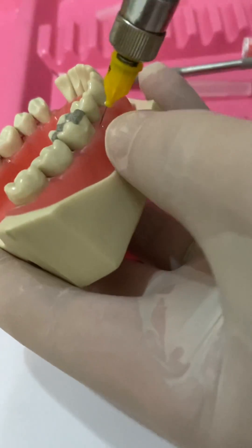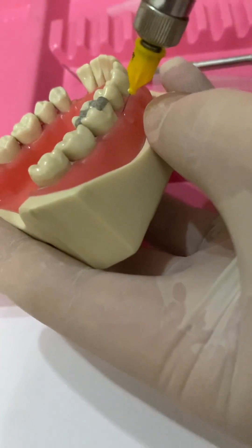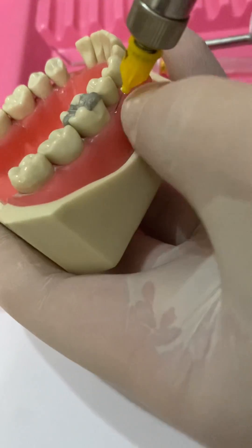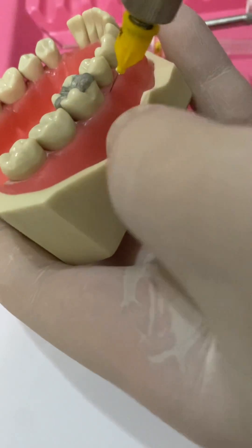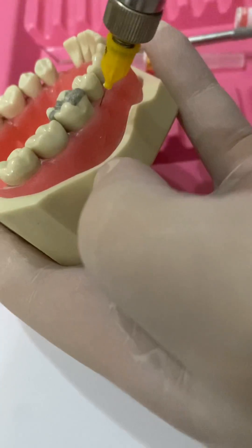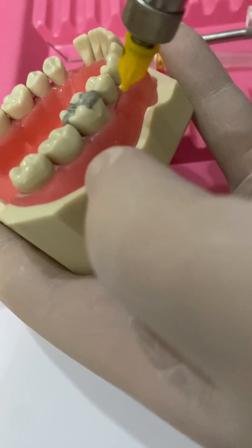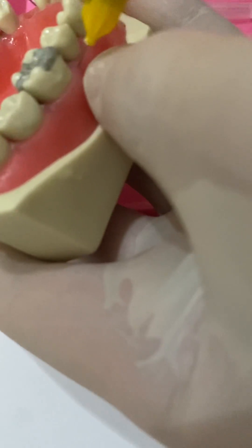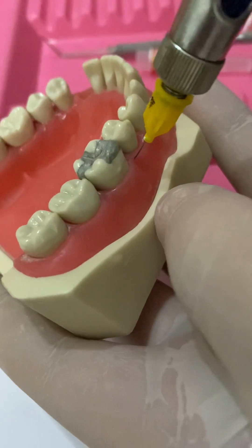This delivers the local anesthetic solution into the intraosseous bone, providing anesthesia for the area in order to perform an operative procedure. We apply it forcefully and should see the blanching area around the injection point.